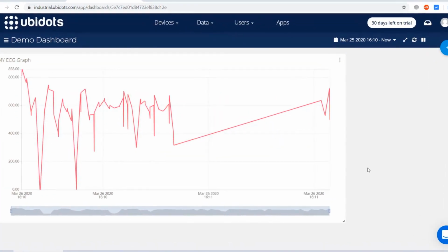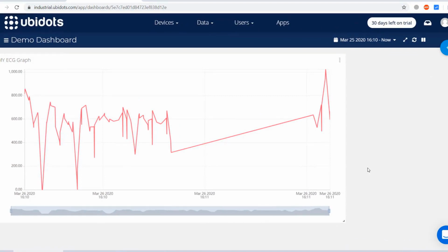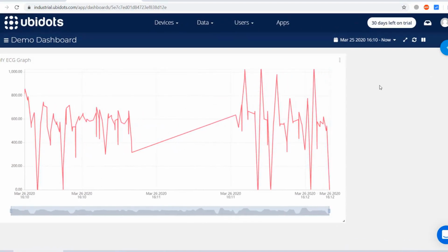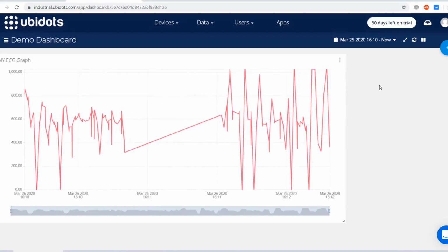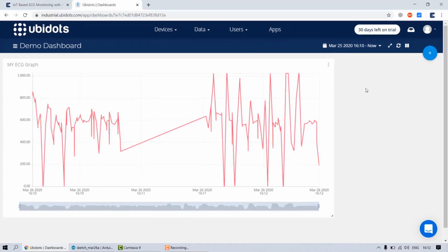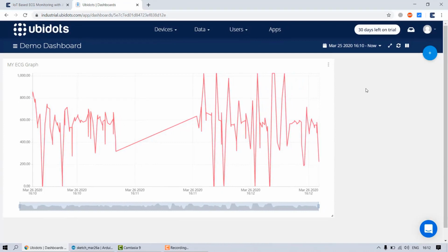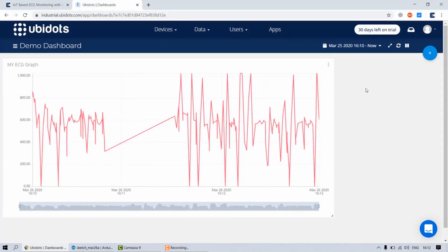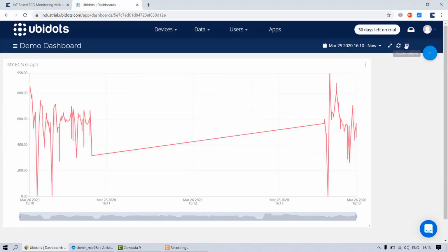So with time, the ECG signal from your body is uploaded here. So uploading will be done immediately. The graph won't be as smooth as you saw earlier in the previous code. This is because Ubidots requires a fraction of time to upload the data.